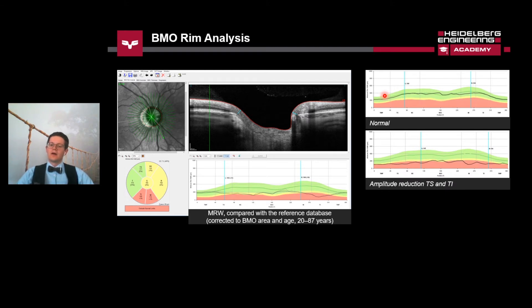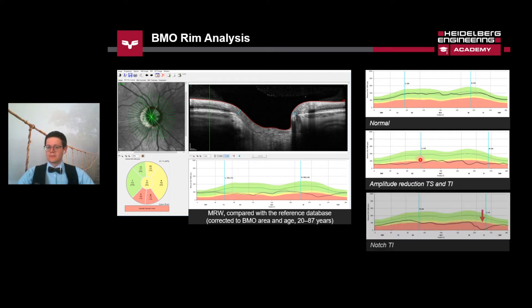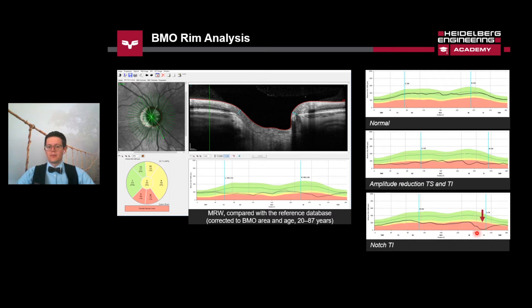The next histogram shows an amplitude reduction on the temporal superior as well as temporal inferior side. It doesn't look parallel anymore because we don't have the two little humps seen in the normal mean value of the reference database — so in this case we have lower values than expected. In the last example, the histogram starts parallel to the green line but then drops down, with a very hard drop at the temporal inferior part, indicating thinning where the nerve fiber layer at the Bruch's membrane opening is thinned compared to the temporal superior part and the reference database.